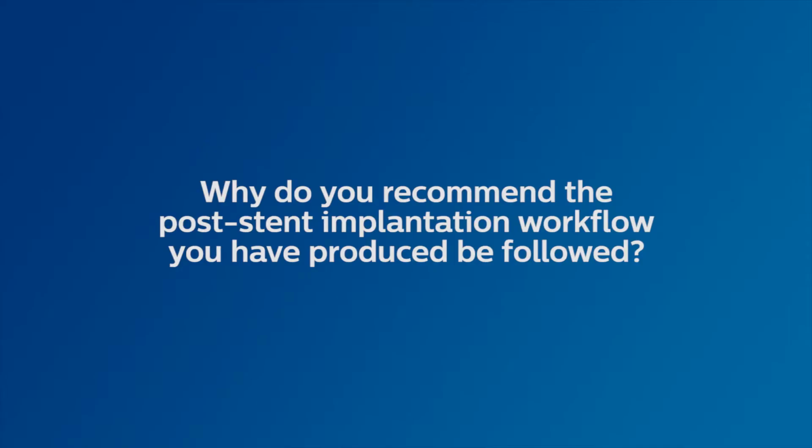Another question you will have to answer is, if I choose such a big stent, am I playing safe? Do I have positive remodeling, meaning a large vessel around it that will not break or rupture when I implant such a big stent, or on the contrary, do I have negative remodeling? And finally, you need to know also the information about the length of the stent.